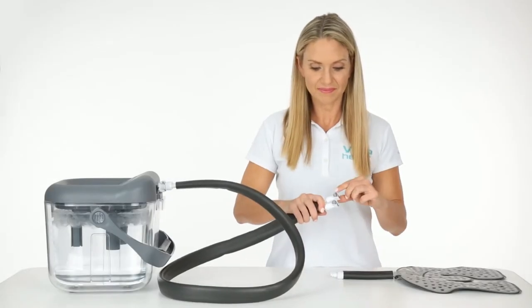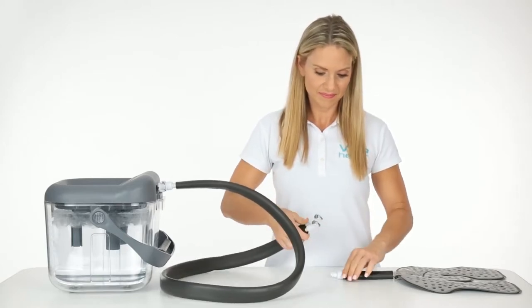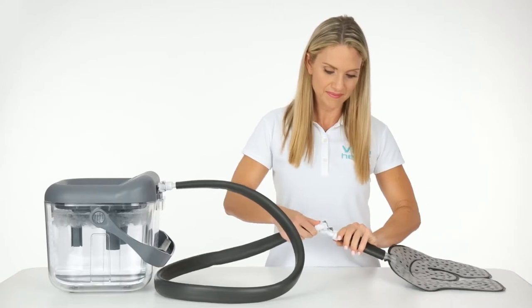To connect the cold therapy pad, push down on the metal lock above each hose valve and push the nozzles in until you hear a click.